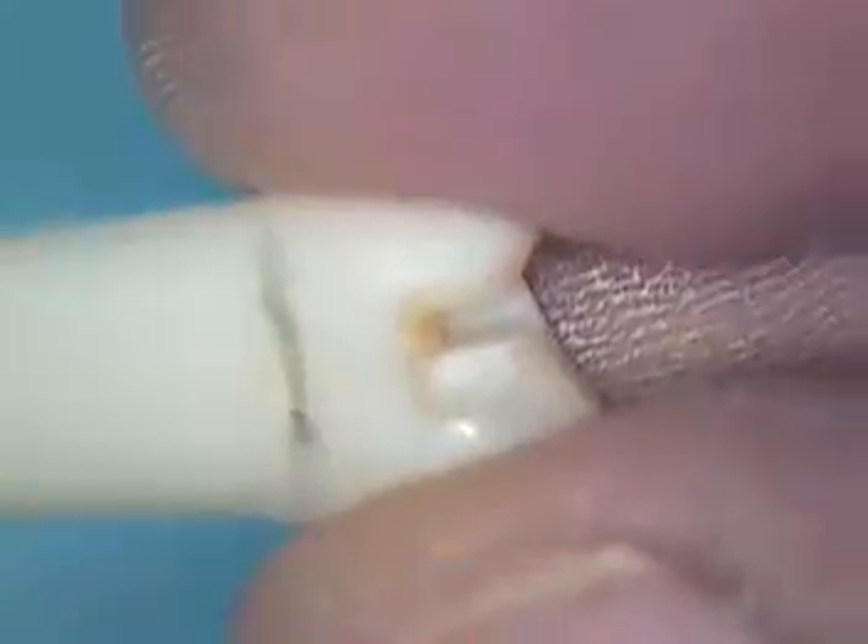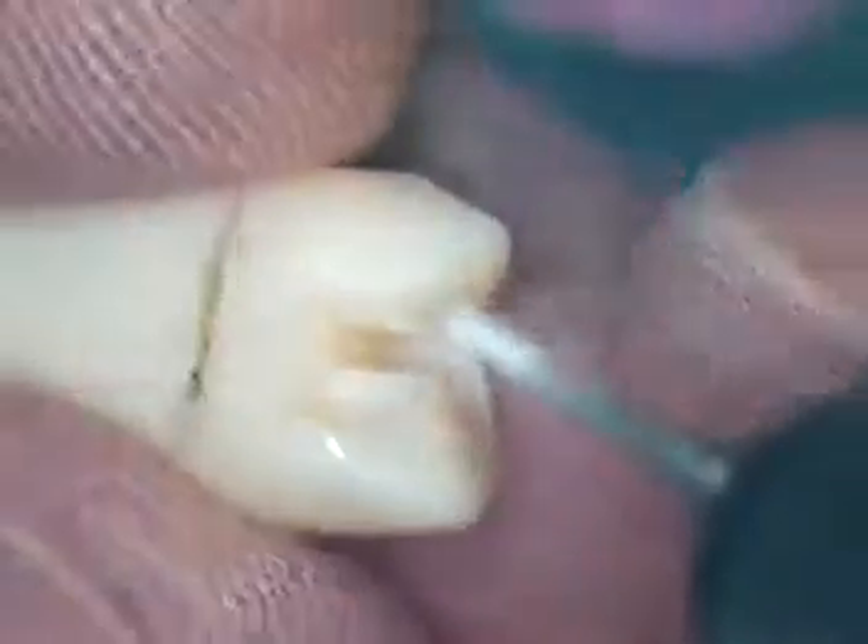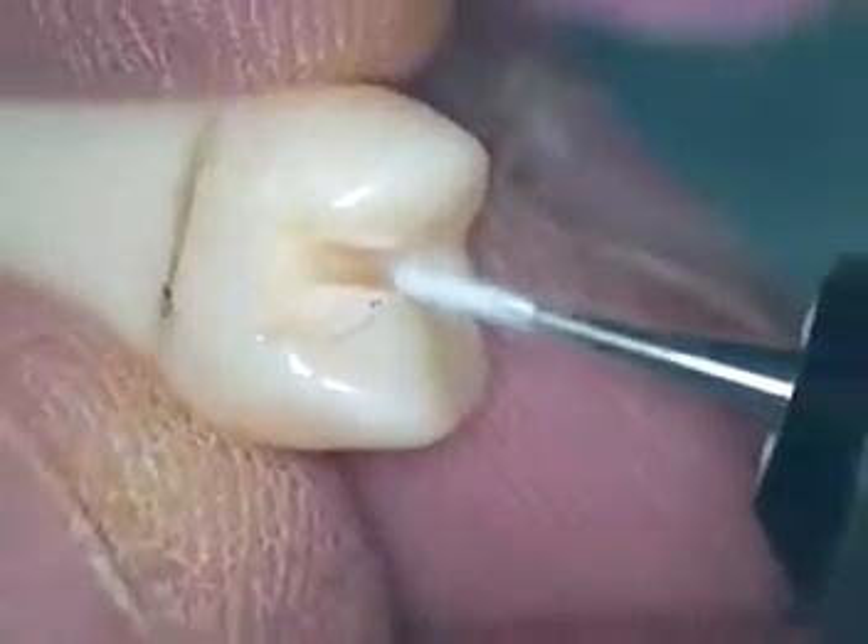Hello and welcome back. This is Dr. Jerry Cuomo with you on the next step for the class 2 premolar preparation design. I went ahead and marked the gingival aspect — lots of room there. So I'm going to go ahead and make my depth cuts.